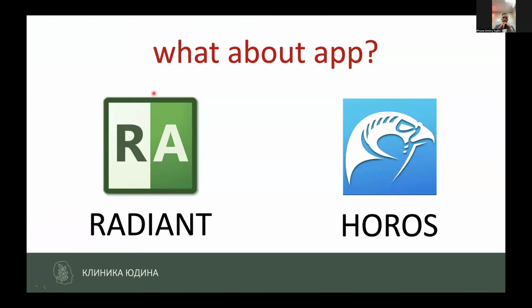From what app should you look at your MRI? If you use Apple technology, I mean your laptop works on Macintosh, you can use the free app Horos. Or if you work on Windows, you can use RadiAnt. Those apps work great with any kind of DICOM files.